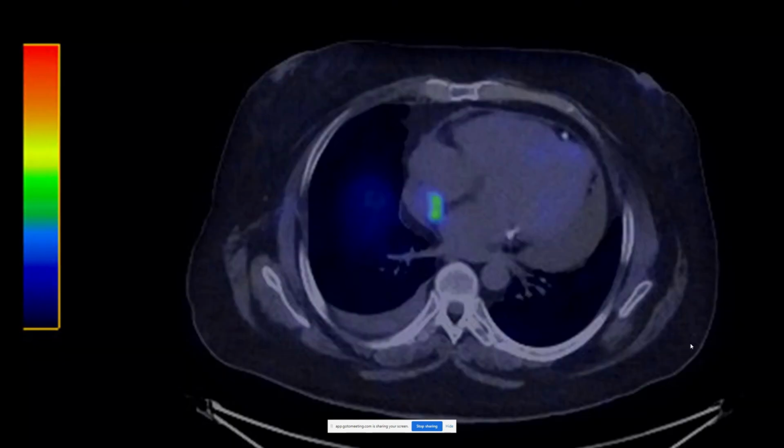That pericardial effusion looks high attenuation, is it? They reported at the outside it was kind of serous sanguineous. It didn't have a high hematocrit or anything like that. The cytology was negative. The tissue that was sent from the outside was negative.